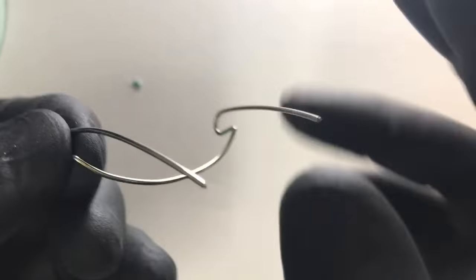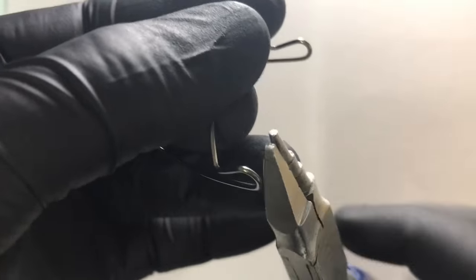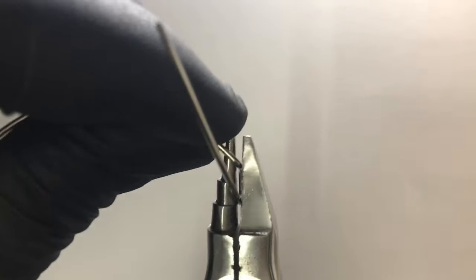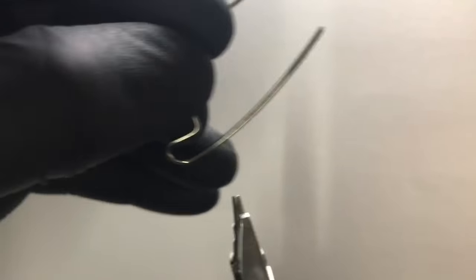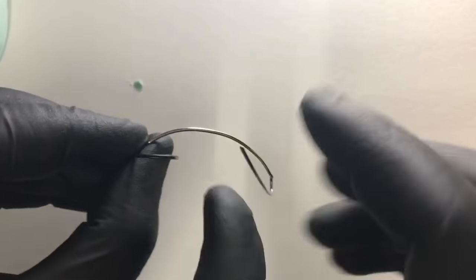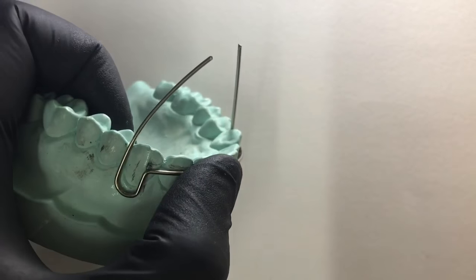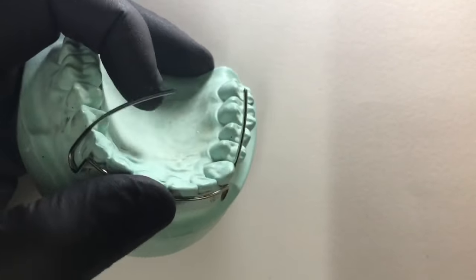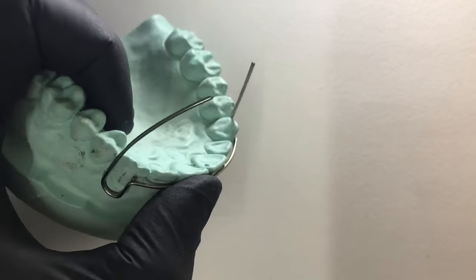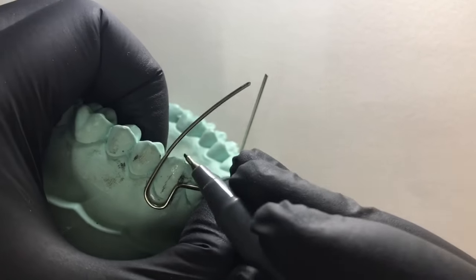Remember that these U-loops should be in the same plane as we have formed the arc of the bow, so we need to do slight adjustment in this case. This loop should follow the arch. Now we can see the wire component is completely adapted and engaging into the distal embrasure of the canine.